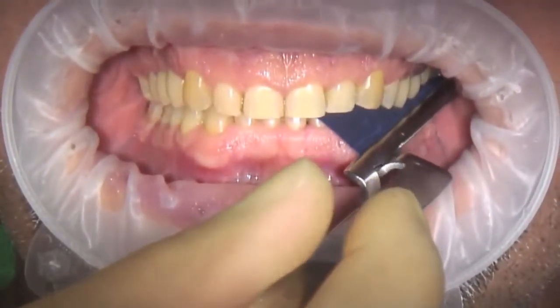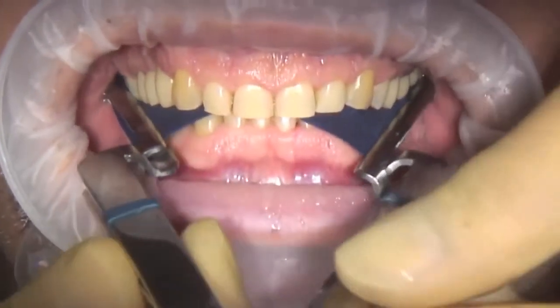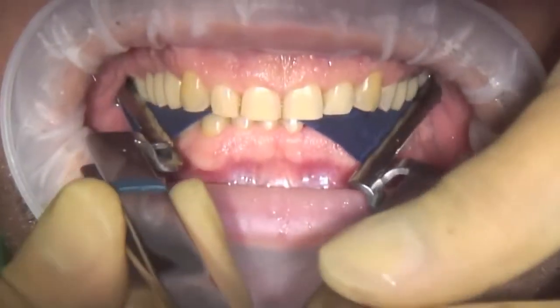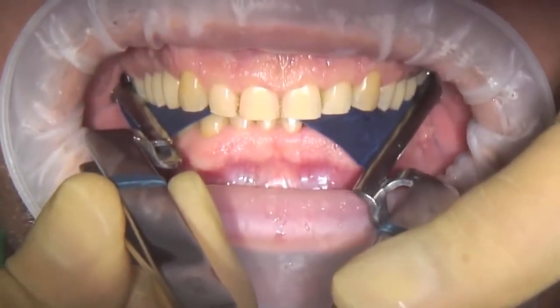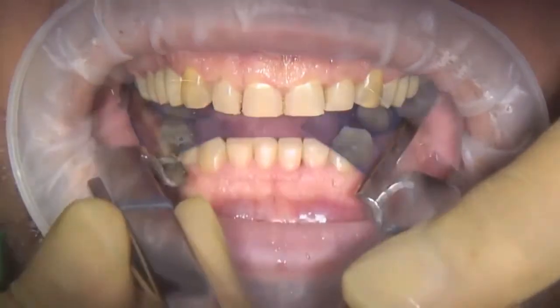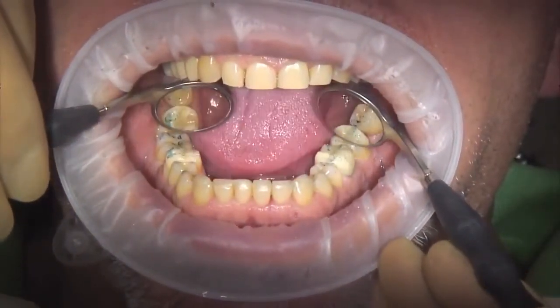This unique combination with the bonding agent Trans-Q-Lase enhances detection of high spots on hard-to-locate surfaces, such as highly polished metals or ceramics. Its hydrophilic properties make it advantageous for use on moist occlusal surfaces — a highly desirable attribute.